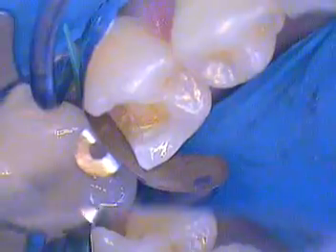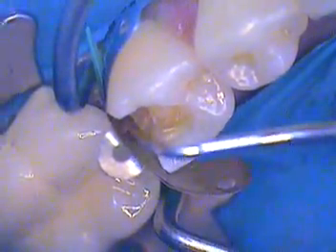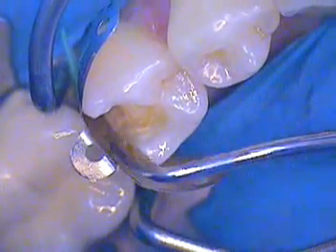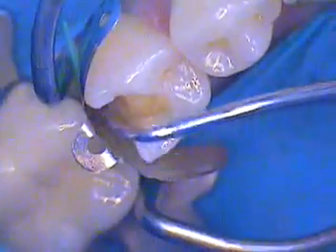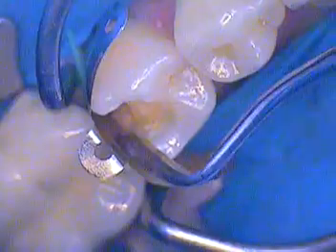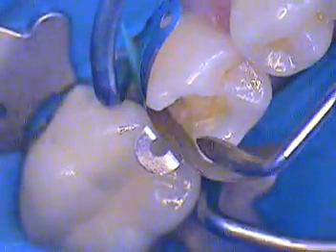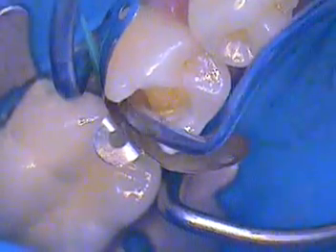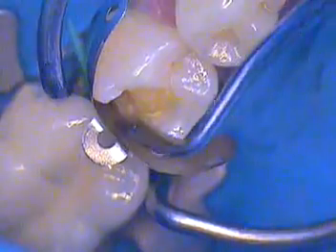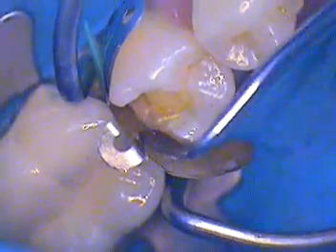Double check it, especially internally. Now burnish — you want to use a good Hollenbeck No. 7 and burnish the contact area. Not on the marginal ridge, but in the contact area. Go below the ridge — you'll see it, you'll feel it. That little depression right there, that's your contact area. Create it. Make sure you've got both width and height to it.